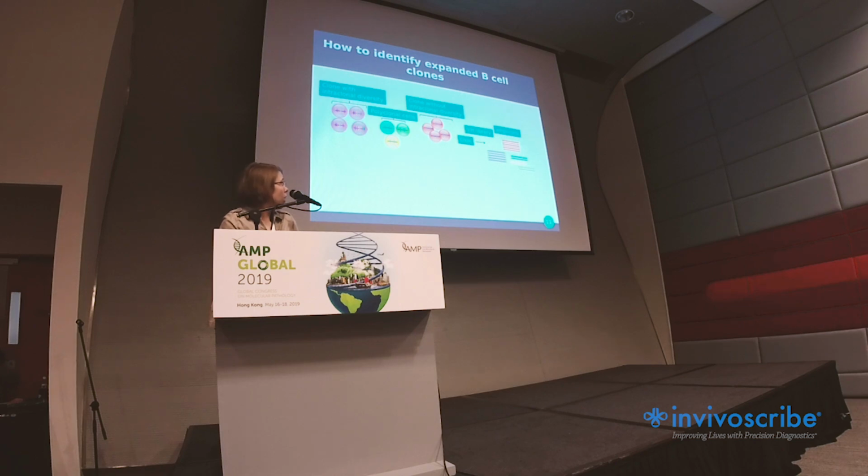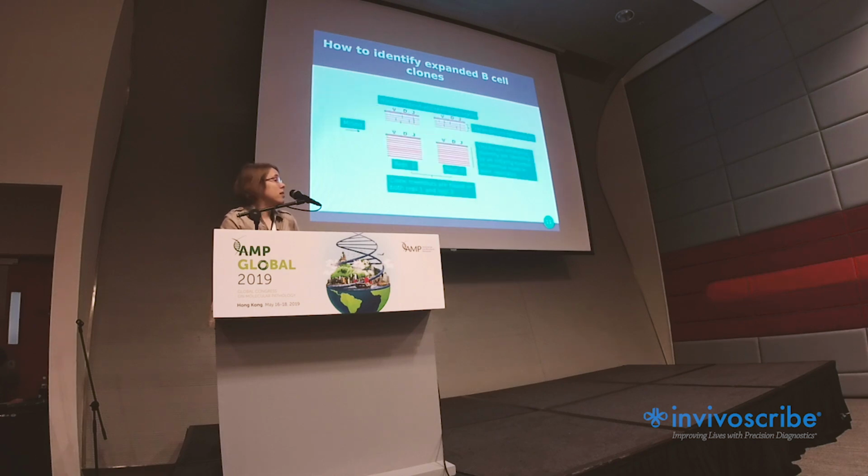You generate DNA and the library from this, get amplicons, then sequences, and have the problem of finding the clones inside. So we have written our own bioinformatics software for this, which does a VDJ search. It identifies the V gene and the J gene for the sequence, and then searches for the CDR3 inside. All those sequences with the same V gene, the same J gene, an identical CDR3 length and identity of 90% in CDR3 are called a clone if we find it in both replicates.